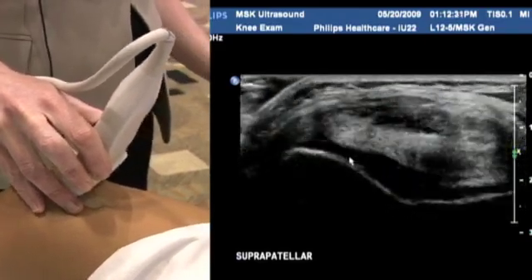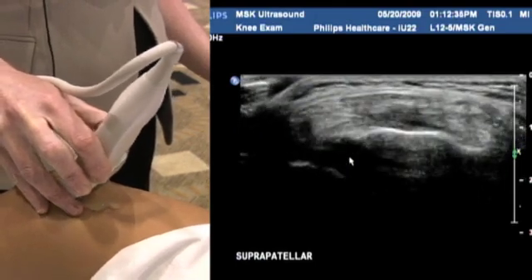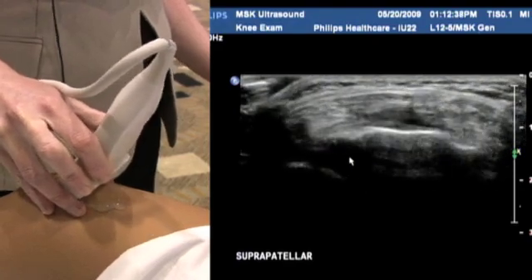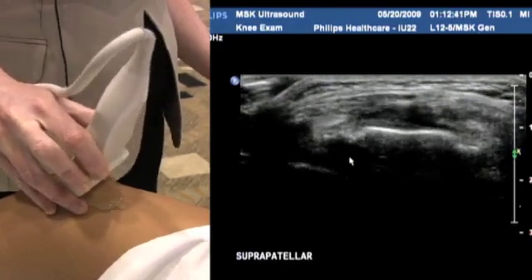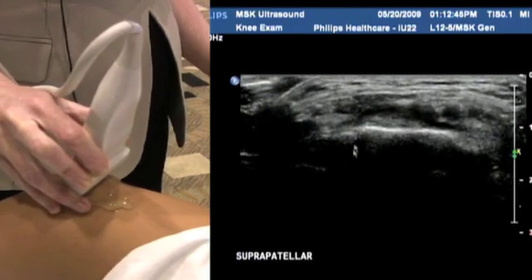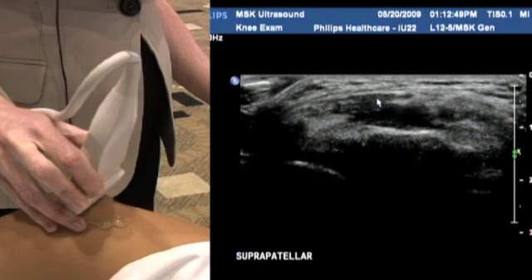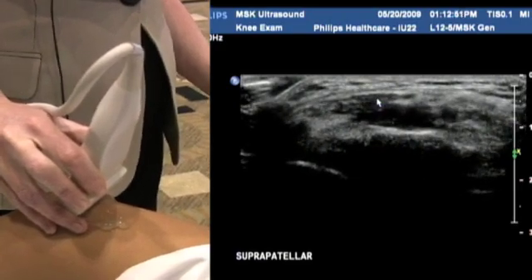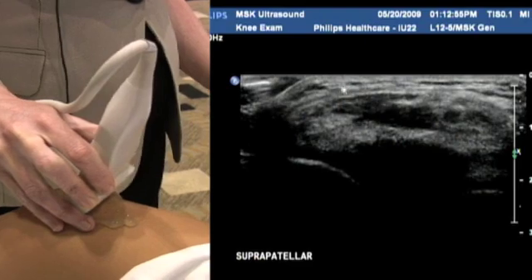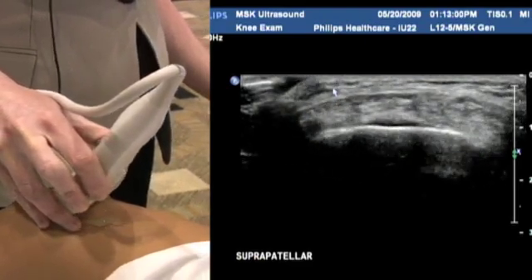And we scan all the way down until its insertion on the patella. Again, you have to be a little careful with anisotropy here and make sure that you heel-toe the probe effectively, because if we heel more than a few degrees away from perpendicular, you can see how hypoechoic this tendon becomes. And that's indicative of tendon tearing or tendon inflammation, tendinosis. So you don't want to create a false positive there. So just make sure that you keep 100% perpendicular to the tendon.